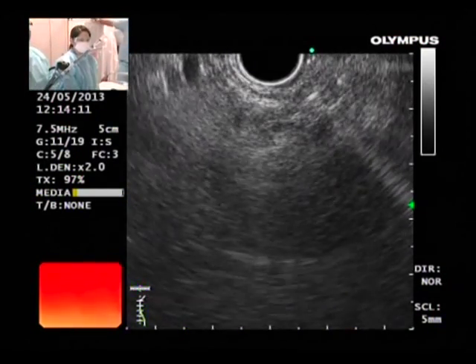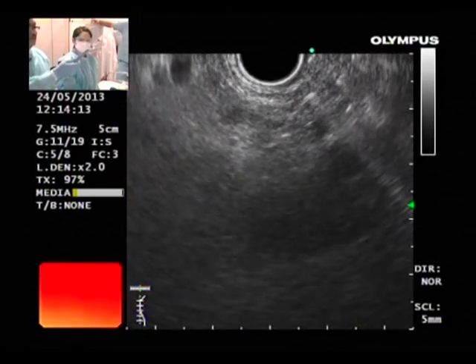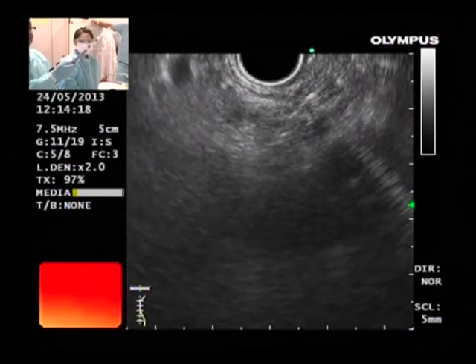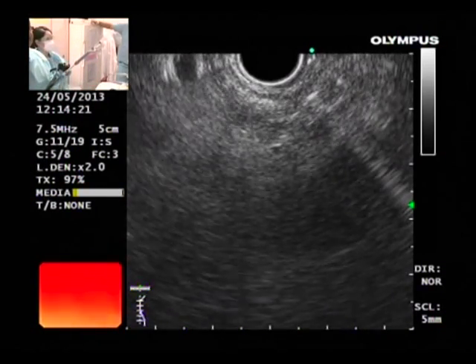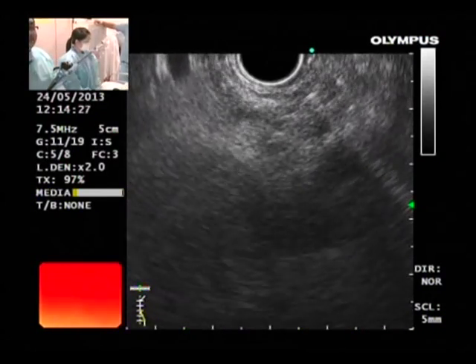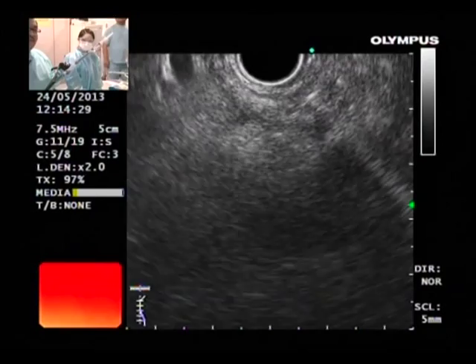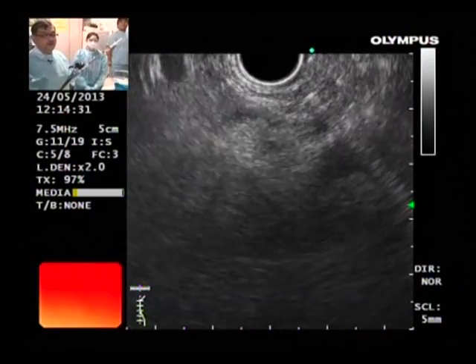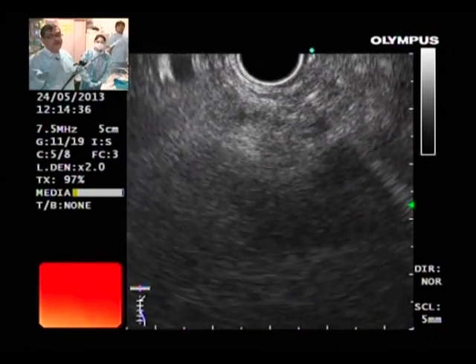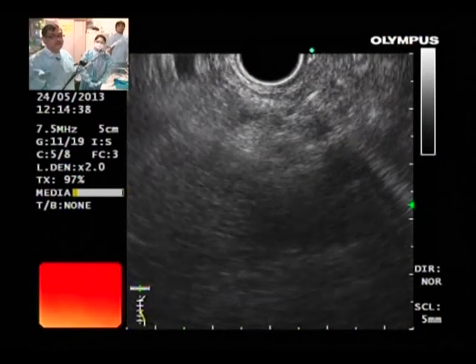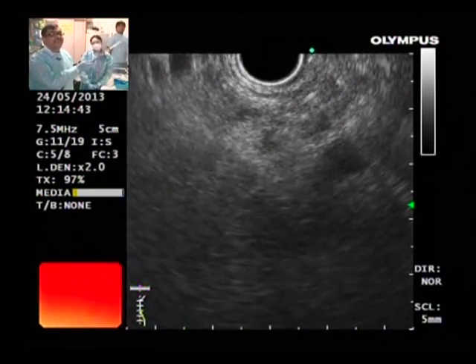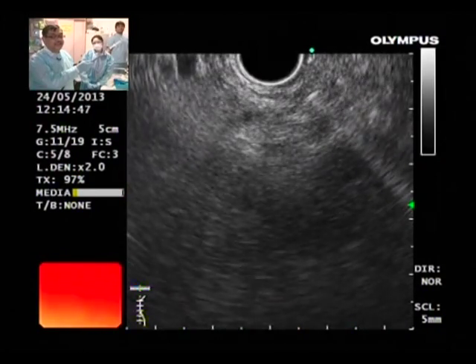This is the easiest procedure to perform for those who are starting interventional EUS. For this case, do you do one side or bilateral? If you see the ganglia, inject into the ganglia — that is what I feel. Don't go here and there. Here we are lucky we saw the ganglia. If we had not seen the ganglia we would have debated one side or two sides. My personal preference is one side.